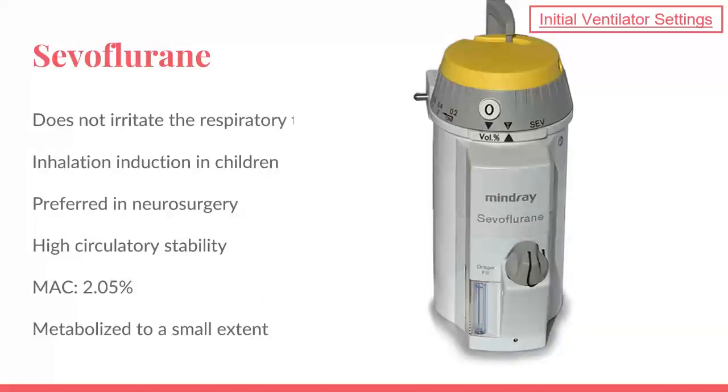Another anesthetic gas, often considered the king of the operating room, is sevoflurane. While nitrous oxide is delivered directly, usually through fresh gas outlets, sevoflurane, desflurane, and other anesthetics are delivered through specific vaporizers, like the one shown here. Each anesthetic is designated with a specific color. For sevoflurane, the color is yellow. It does not irritate the respiratory tract. While all anesthetic gases smell unpleasant, sevoflurane's smell is tolerable.